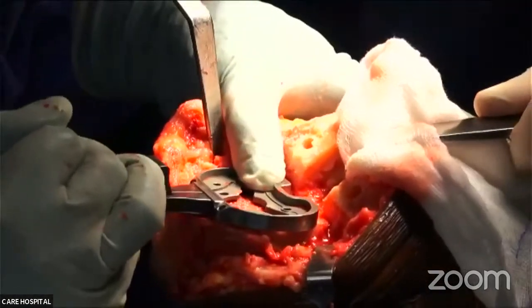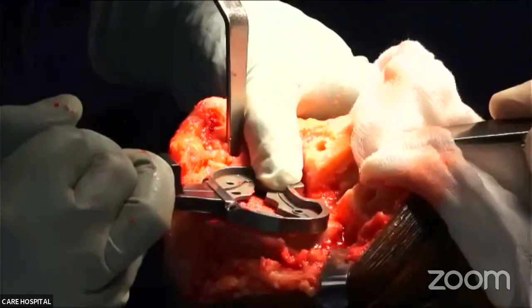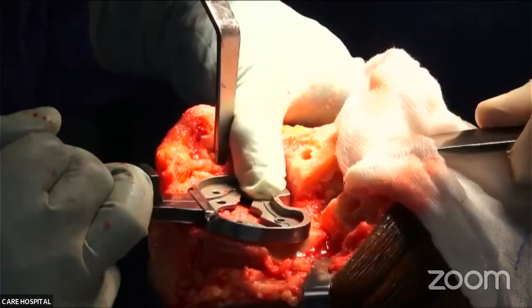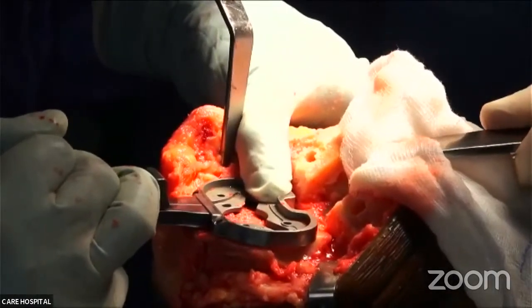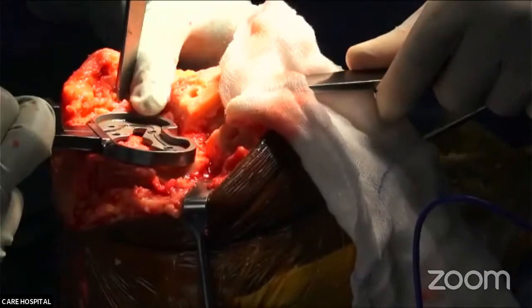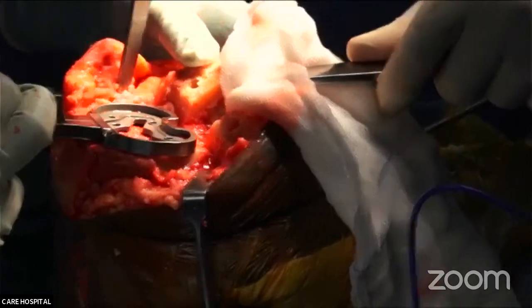Okay, pins. The posterior medial bone, you have to do a reduction osteotomy, I believe.